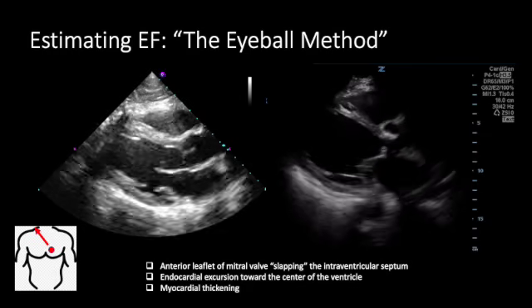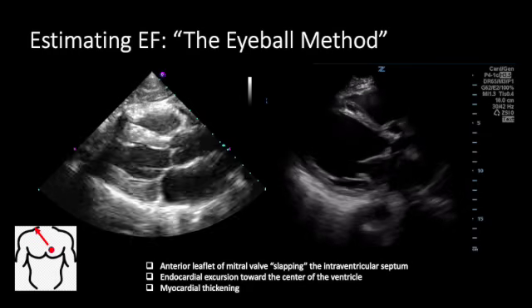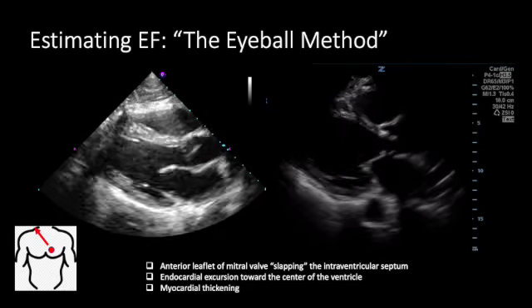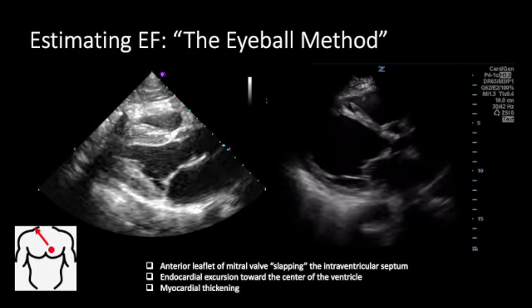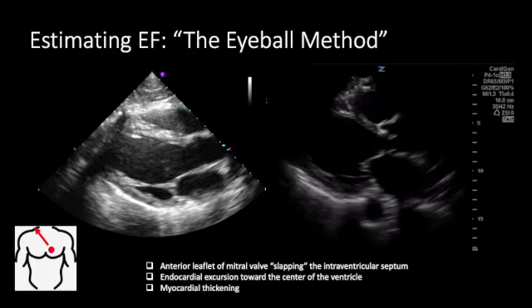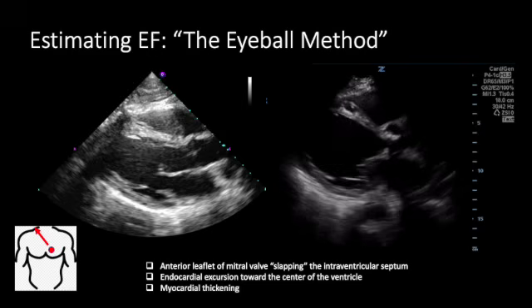So if we look at these two images once again, and now we take these qualitative approaches of examining the anatomical findings inside these two ventricles, we can quickly determine that one does exhibit all three and the other does not.